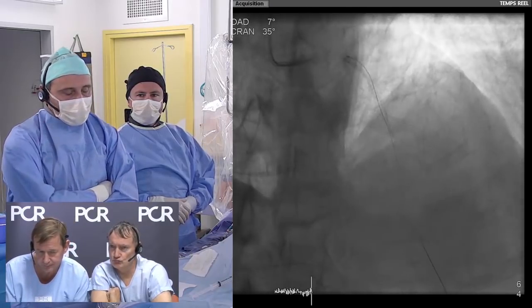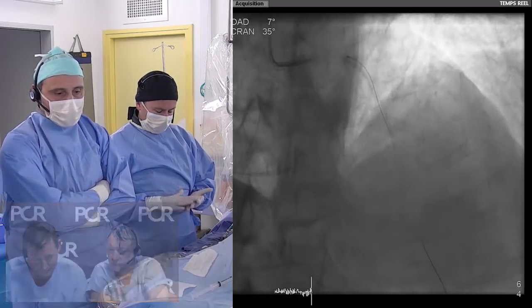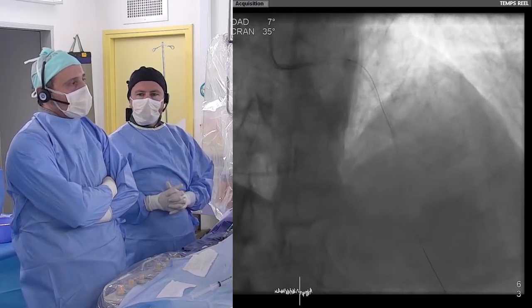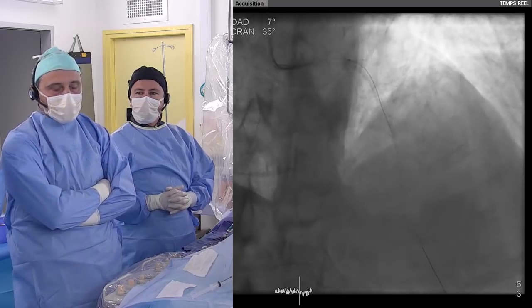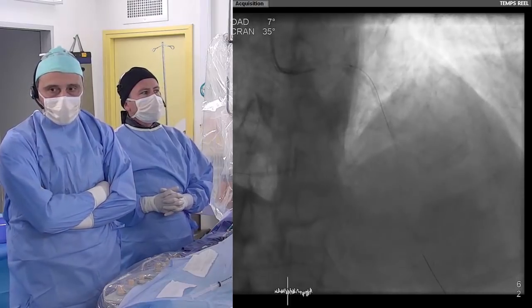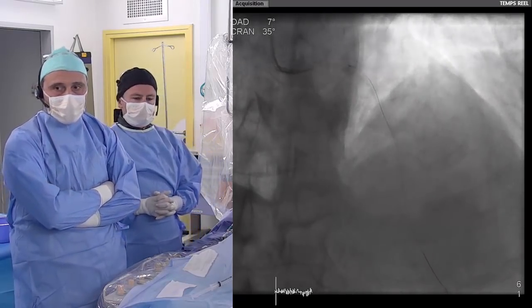Yeah, actually, that is a very good comment. We wanted to know upfront what should be our strategy instead of finding it out during the course of the procedure. You know, taking decision at this step might be key to the success of the whole procedure. We need to decide now whether we go for rotablator, yes or no, and we need to decide now from where to where we stent and whether we have to treat the left main as well.